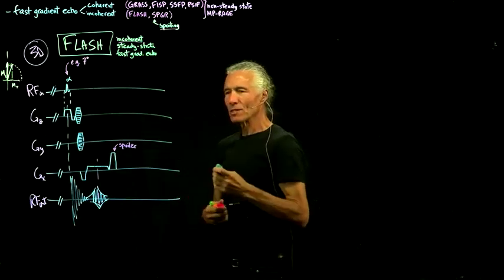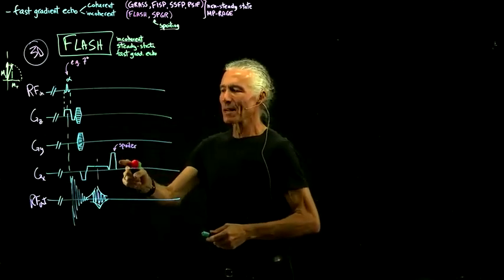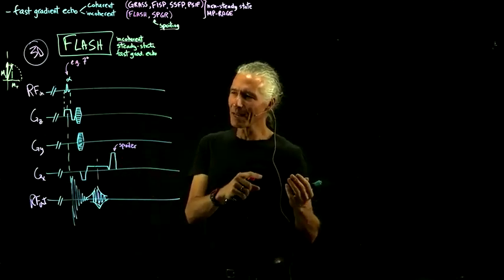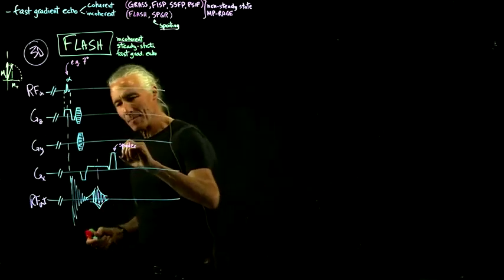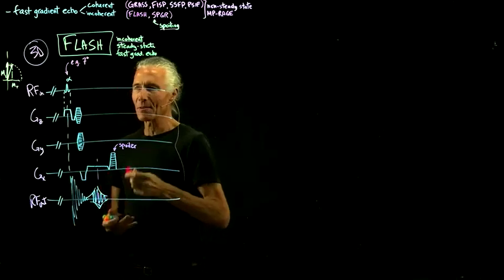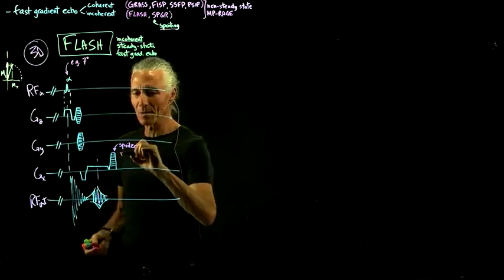Now, if you just do exactly the same size all the time, well, then sooner or later you could run into some kind of problems down the line. And so a lot of times what happens is you just pick random. So you could pick a random amplitude.